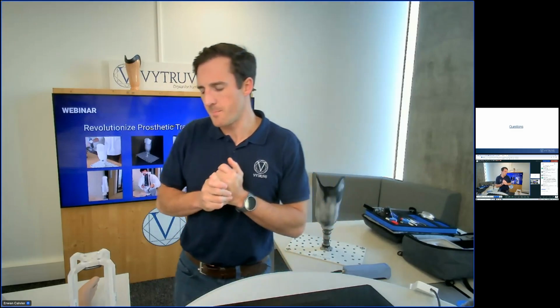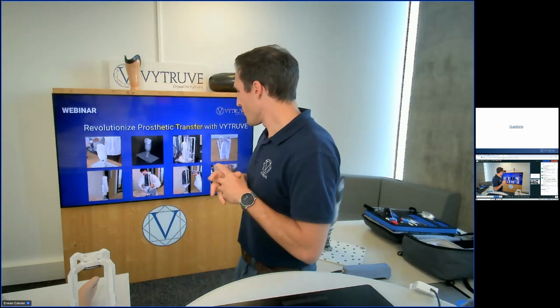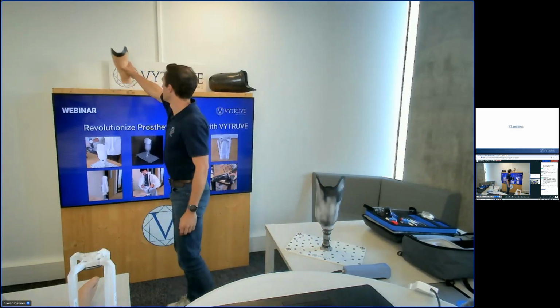People are writing, so I am waiting. It's a very good question, Mike. Maximum, minimum, it's really complicated to do because it depends on the shape. Just to give you an example, this socket.